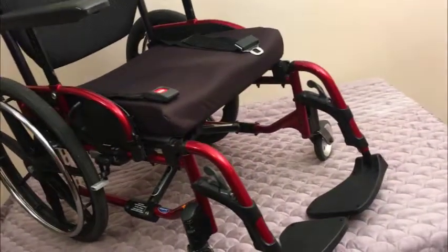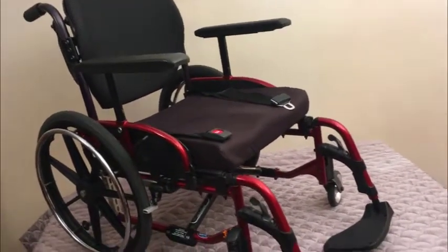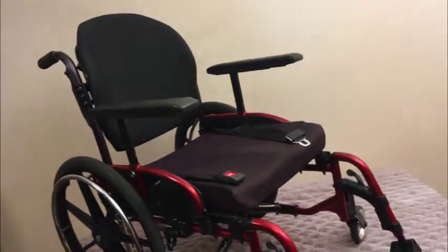So guys, this is a more petite chair. I can see a smaller adult or a younger occupant, like maybe a pre-adolescent child, or maybe a small teenager using this chair.